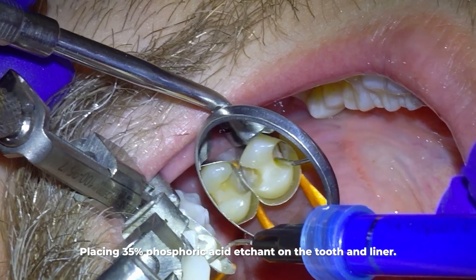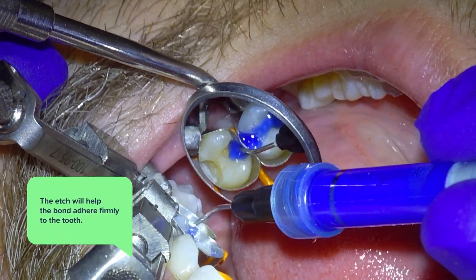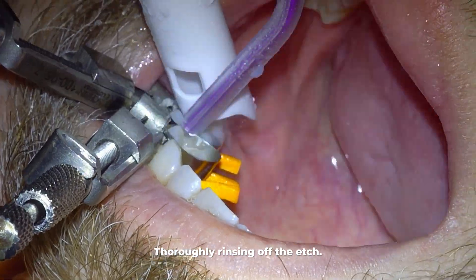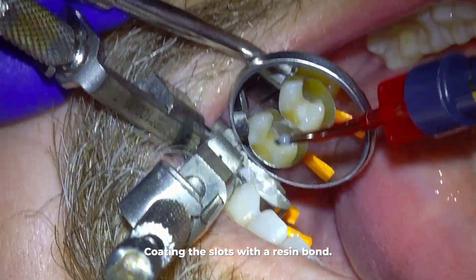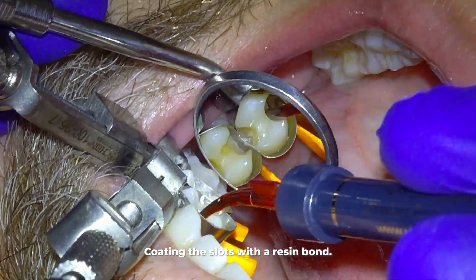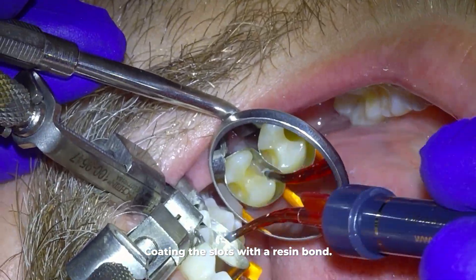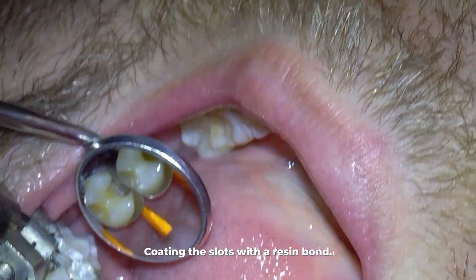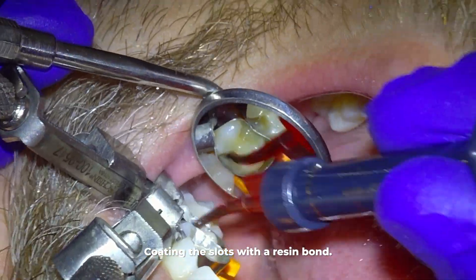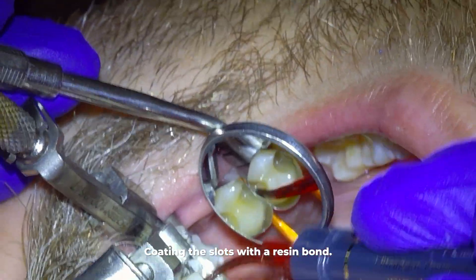After the liner, we place etch on the tooth for a few seconds, which will help the bond adhere firmly to the tooth. We then thoroughly rinse that etch out of the slot and coat the whole slot with bond. I use this bond because it is the strongest bond I have tested — I bonded fillings to pieces of tooth and measured how much pressure it took to break them off, and this bond is by far the best and strongest.